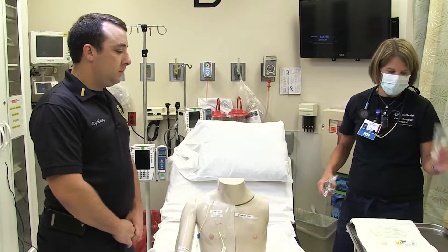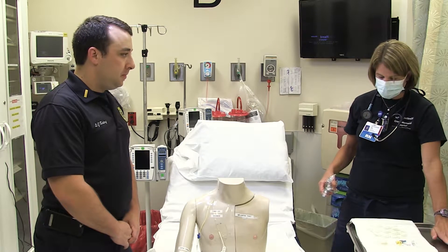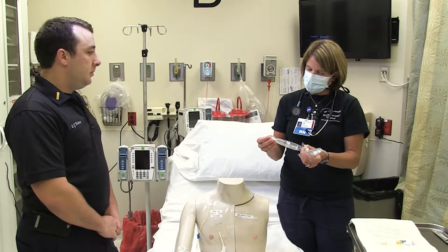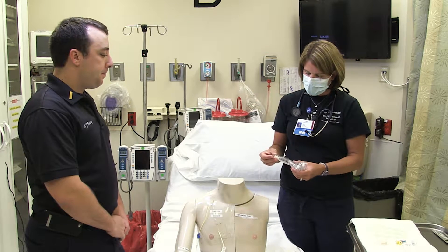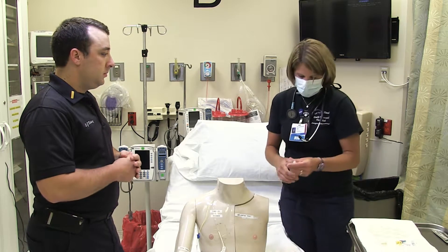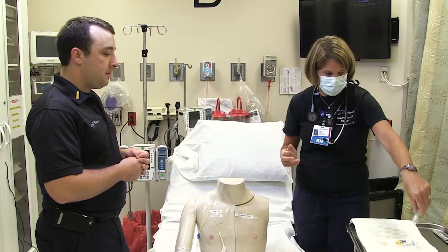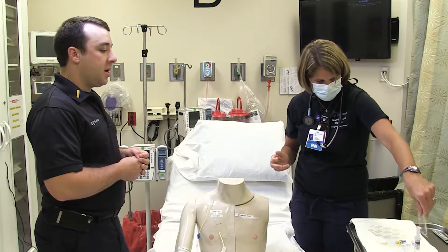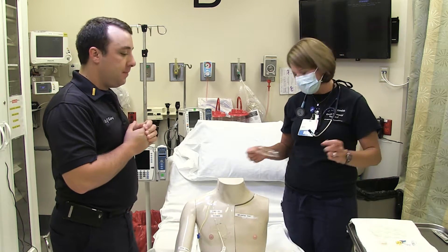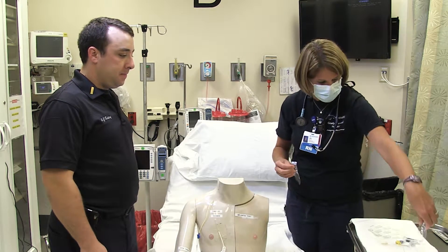Anything that doesn't need to be sterile — like this — you can set it aside; that's non-sterile, clean but non-sterile. We're going to work on getting sterile saline flushes, because it is important. We're going to show kind of two different ways. We're talking about the outside of the syringe itself, not just the saline inside — the saline inside is sterile; it's the outside of the syringe that's not sterile. So we're going to open up a couple of these and just drop them.